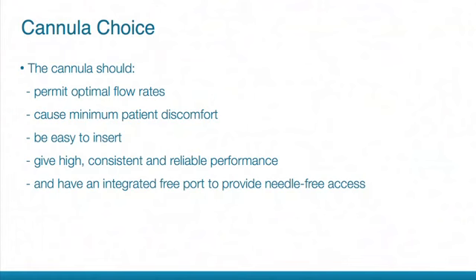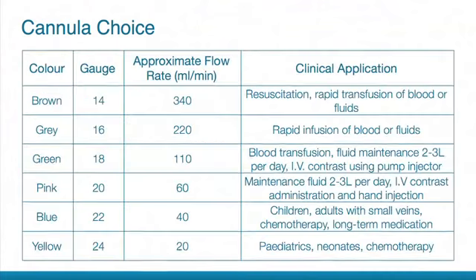The ideal cannula should permit optimal flow rates, cause minimum discomfort to the patient, be easy to insert, give high, consistent and reliable performance, and have an integrated port to provide needle-free access. This table lists the different cannulas in use and their clinical application.